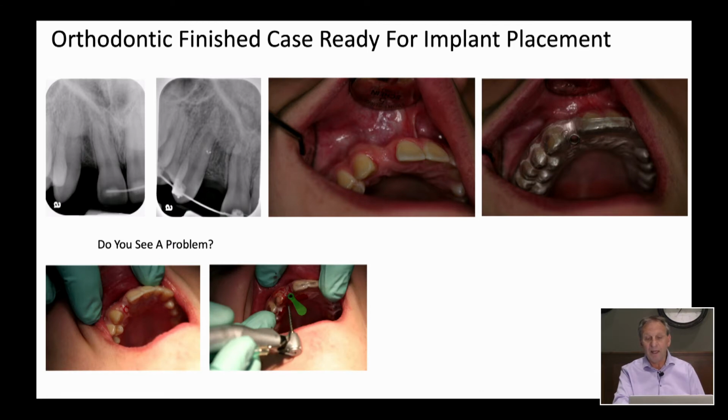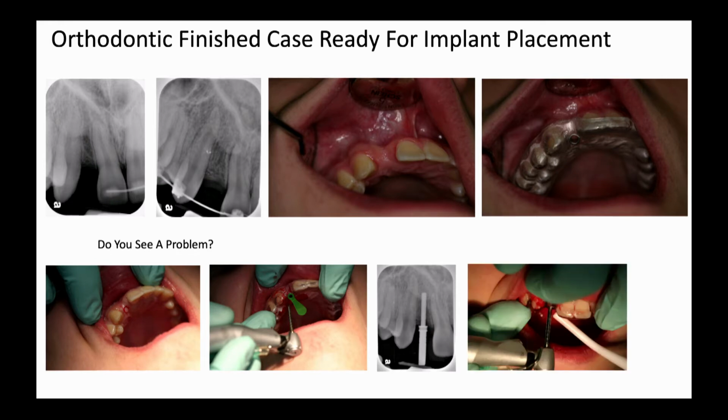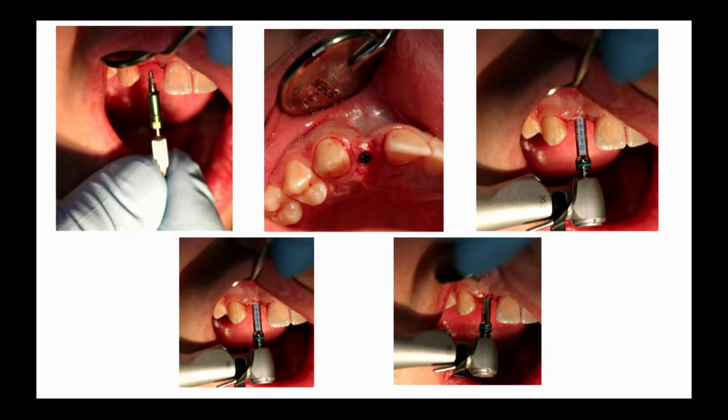We've proven that. So here would be your surgical guide, biopsy punch to remove the tissue, pilot drill to make your initial purchase, parallel pin to verify. You don't trust these guides, but verify, and move the case forward from start to finish. So again, pretty straightforward stuff, not new, but that's what's out there still today, and it works really quite well.